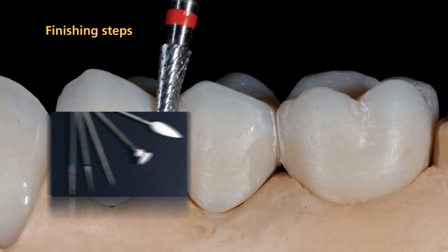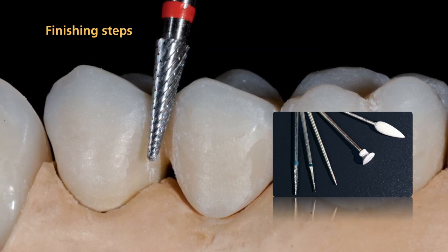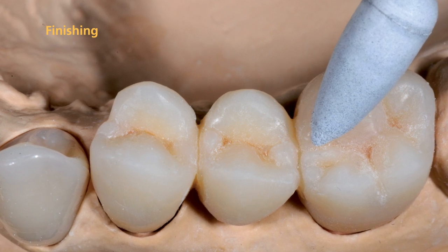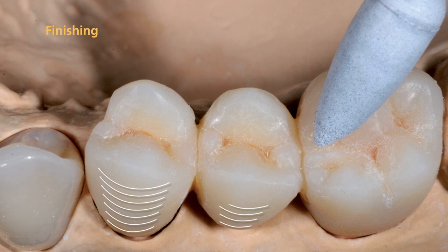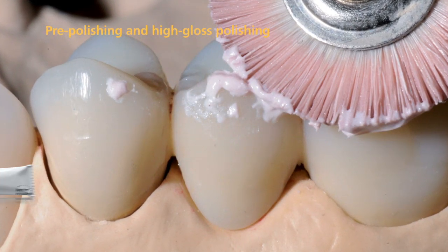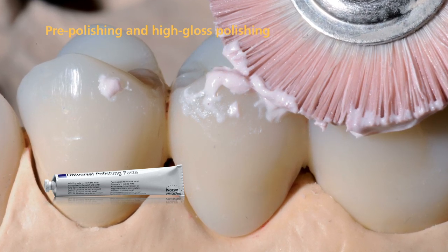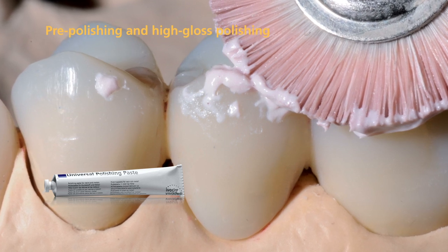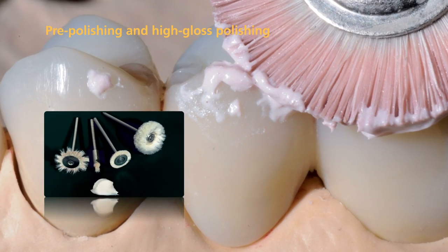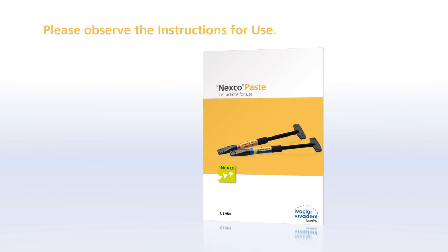Finish the restoration with cross-cut tungsten carbide burrs, fine diamonds, and flexible discs to create a true-to-nature shape. Smooth the SR-NEXCO surface using customary polishers, such as rubber polishers or silicone wheels. Subsequently, establish a lifelike surface texture in the buccal area. Next, pre-polish the surface using universal polishing paste and a goat hair brush. Pay particular attention to the crown margins, interdental areas, occlusal surfaces, and the basal rest of the pontics. Use a cotton or leather buff to achieve a natural high-gloss finish. Please refer to the instructions for use for further details on the application method.